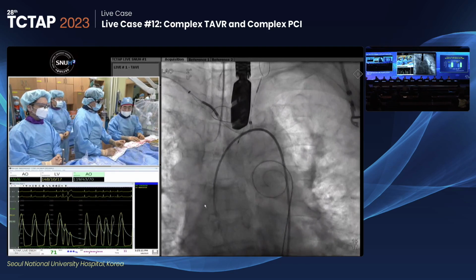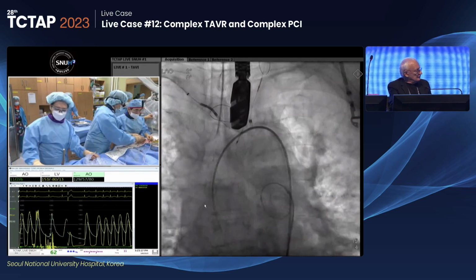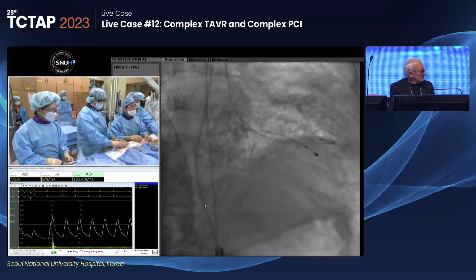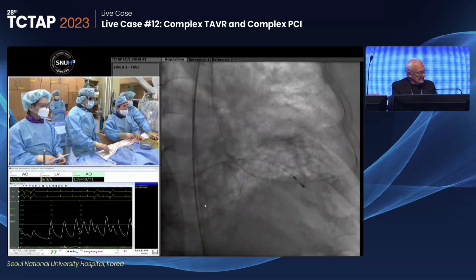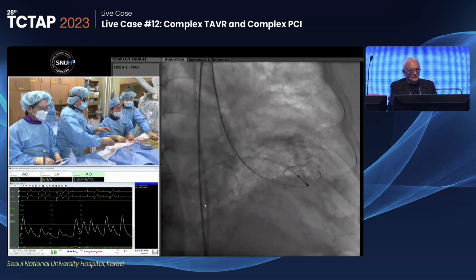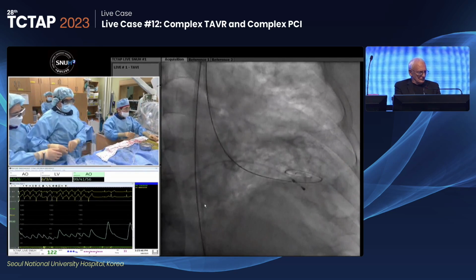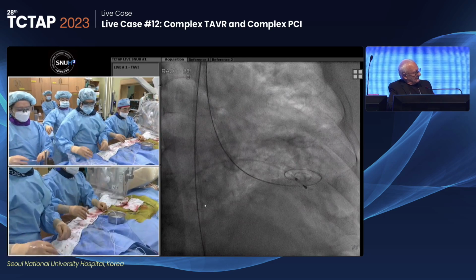No, I think it's as usual from him. It's extremely didactic. He's always reasoning what he's doing, why he's doing it, and how he's doing it. So it's very educational. Arguably, his judgment between the three valves, you could argue, but that's his opinion, and he made his choice to do the Accurate. Personally, I believe you can do any of those valves, the one that you are most familiar with. But I really enjoyed the presentations with him, I have to say. Sentinel here is a good choice. The only thing that I disagree with is that stroke in young age is more valuable than in older.